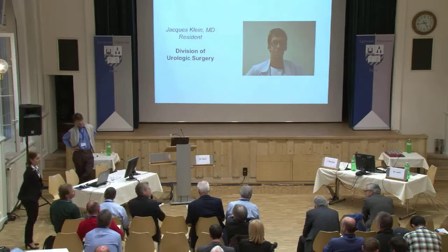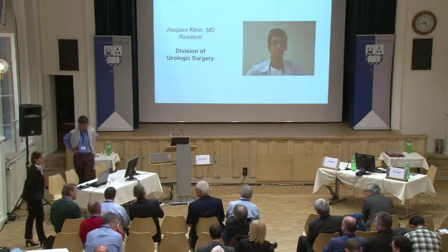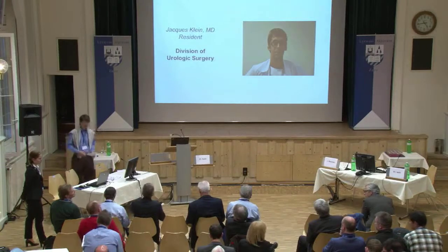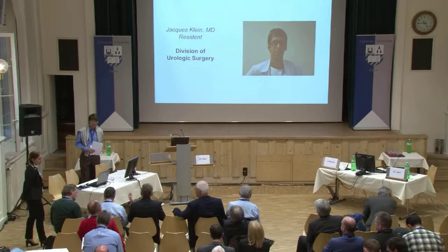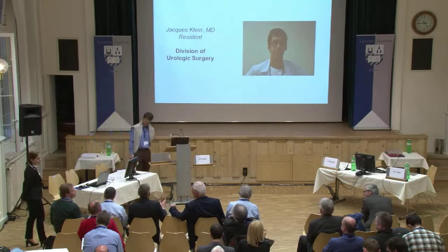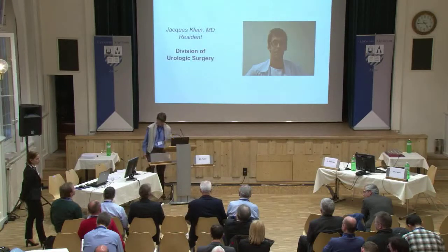Just a short comment. As I was told, I shouldn't ask a question because we're running out of time. One criticism I have of the study: if you see patients with suspicious PSA and you see some focus in your PET MRI and you stick a needle in and there's no cancer, you say the biopsy quality was low. Maybe it's the specificity of the MRI that is low. I think that's something you should discuss as well. And the other thing, changing your management during radical prostatectomy by MRI doesn't mean you make it better. That's something else you should consider. For example, frozen section is something that you can tailor. And this is something you should discuss as well, I think.